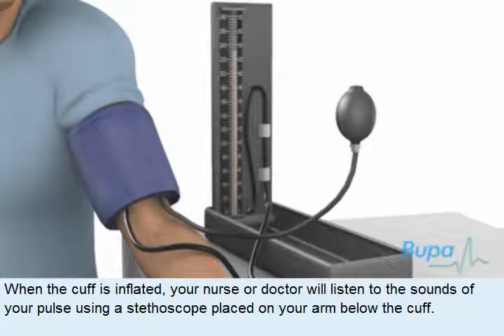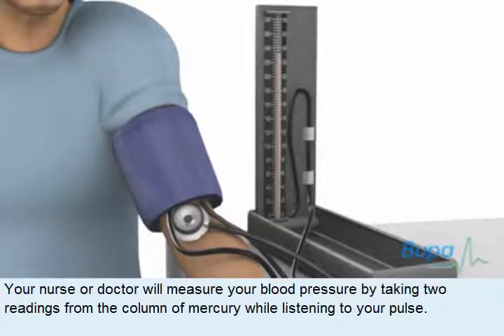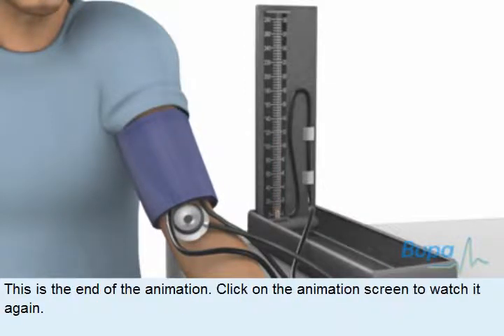When the cuff is inflated, your nurse or doctor will listen to the sounds of your pulse using a stethoscope placed on your arm below the cuff. Your nurse or doctor will measure your blood pressure by taking two readings from the column of mercury while listening to your pulse.